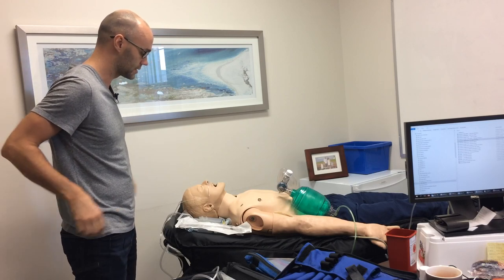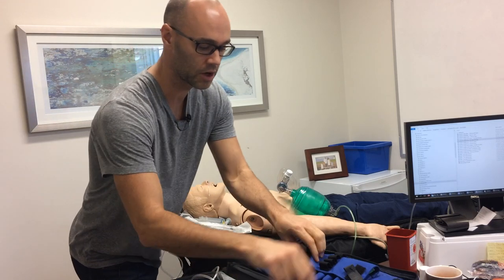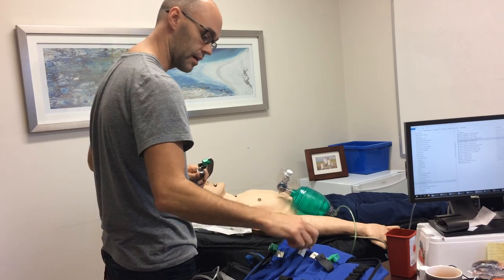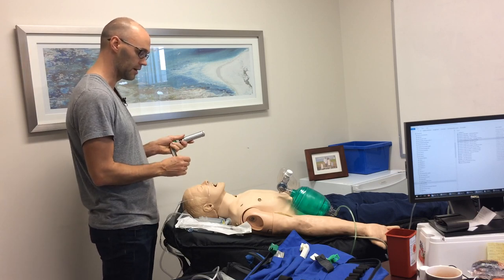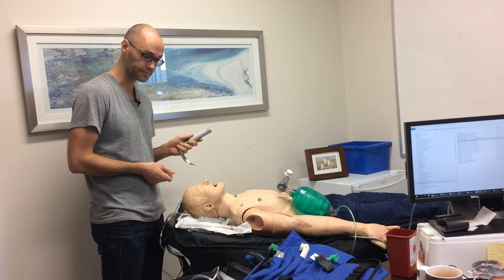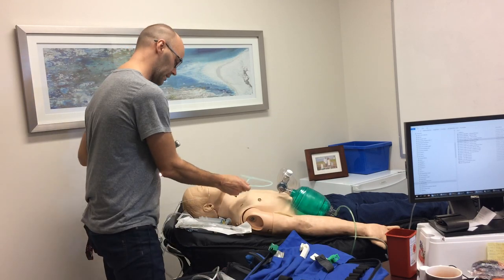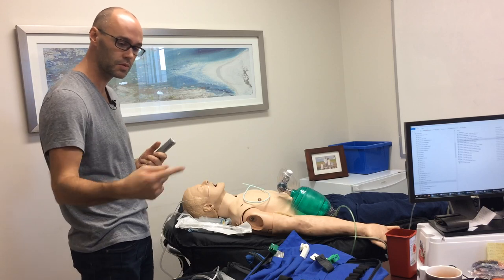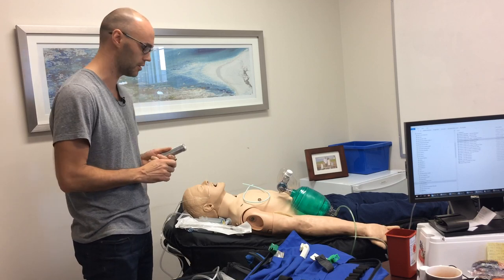Then we're going to go through our BARS — our plan. I'm going to say to my partner: we're going in with direct laryngoscopy first, with a curved blade. If this Macintosh 3 doesn't work, then I have a Miller — a large Miller blade — that I'll get you to hand to me. I'm going to work my way down, try to find the epiglottis and engage the hyoepiglottic ligament. If I'm unsuccessful getting a good view, I may ask for BURP and have you assist with bimanual as well. If that doesn't work and I can get at least a grade 3 view, then I'll try intubating with the bougie. If that doesn't work, I'm going to come out and use an alternate blade. I'll also pull out my AirTrack so I can have an alternate intubation device, and make sure my assistant is familiar with all of those instruments.